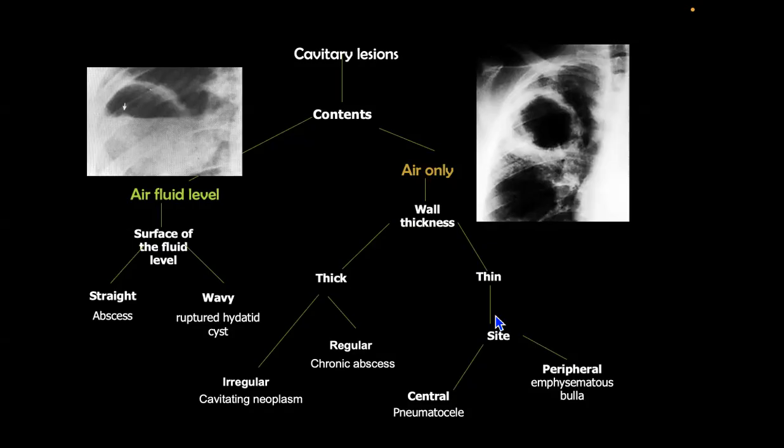For example, if I would like to diagnose pleural effusion, ultrasound is better than X-ray. If I'd like to diagnose even basal consolidations and peripheral consolidations, ultrasound is very much preferred. And even for the pneumothorax, we can do ultrasound. We do our M mode, we see the pattern of M mode, we have the seashore sign and other things. We can diagnose pneumothorax on that.